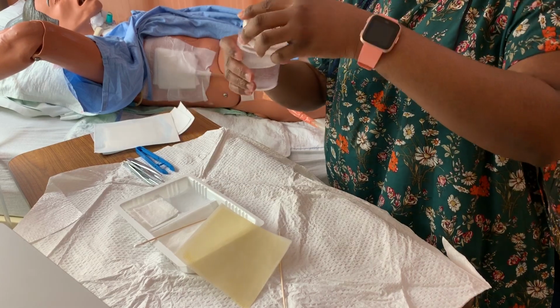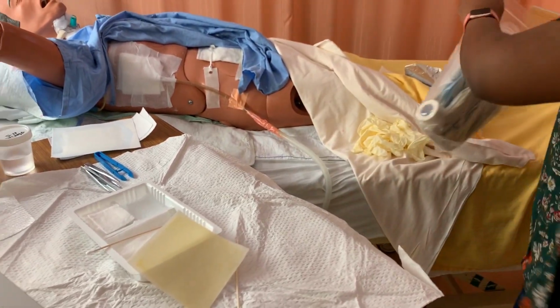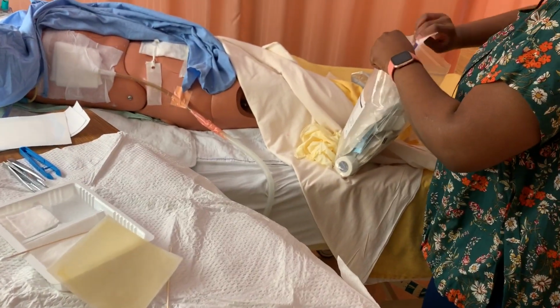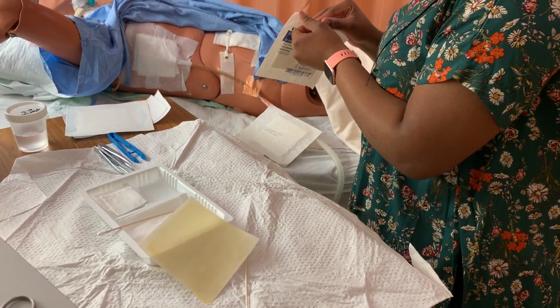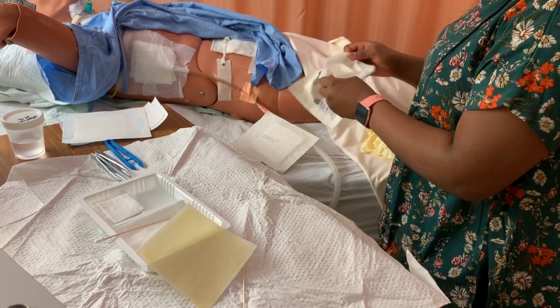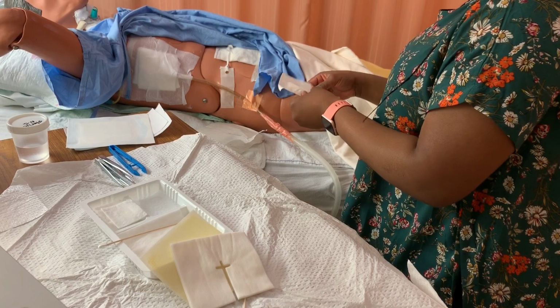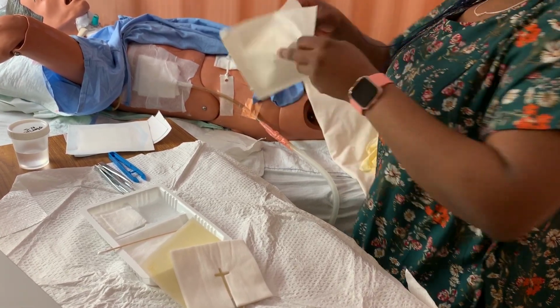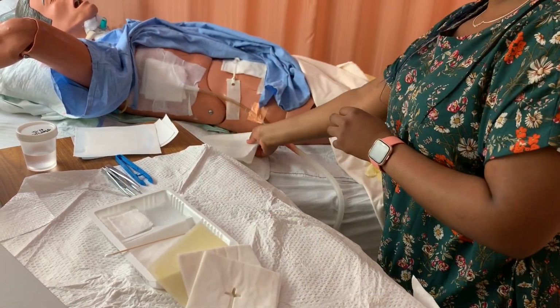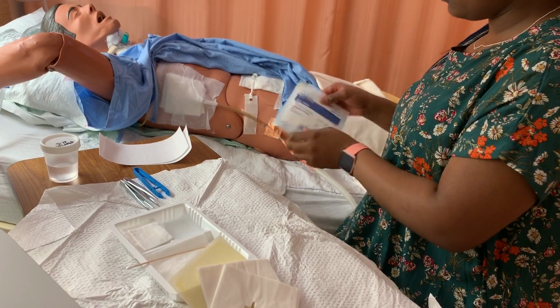I also need extra drain sponges, so I'm just gonna bring out my drain sponges here. And I'm gonna get extra gloves just in case I need it.